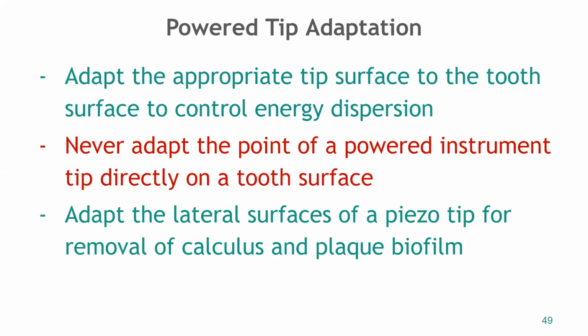So we want to adapt the appropriate tip surface to the tooth surface to control energy dispersion. We never want to use the direct point of a powered instrument directly on the tooth surface. So important. That will be a board question. It will be a question on your exams. We never ever use the point of a powered instrument. So the very tip we don't use on the tooth surface. You can use all other sides. We want to adapt the lateral surfaces of a piezo tip for removal of calculus and plaque biofilm, okay?